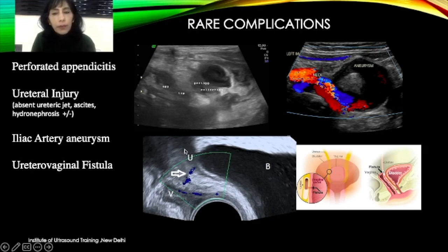What you have to do is just focus here and put Doppler, and you would see that the urine flow is going towards the vaginal area. Can you see this blue color? It's a little subtle, so you will have to keep the velocity range low, not very high, and observe for a certain period. We cannot see the ureter if it is normal, but if the urine is flowing from the ureter to the vagina, you may be able to detect that flow by Doppler.